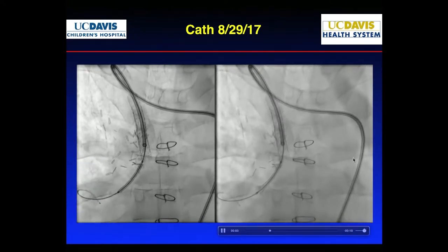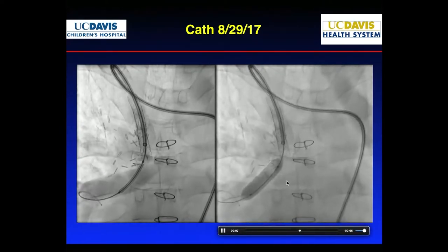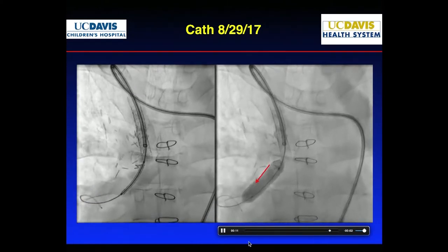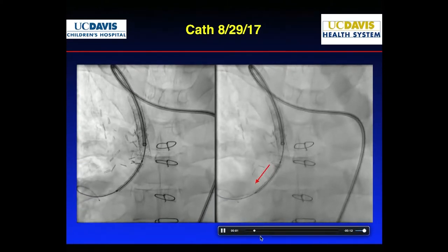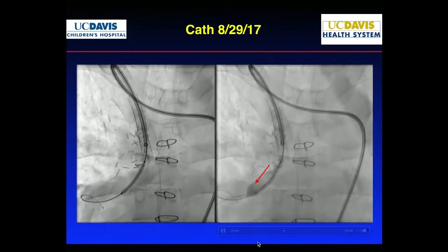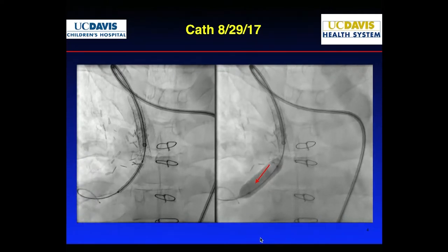So of course, with all the curves, we don't have a lot of control over the wire. And you notice that as we inflate, notice that little subtle movement, right? So I'll show it again. As the balloon was inflating, the stent actually shifted a little bit forward. So it's not in the right position now. We might have ballooned it, but certainly it's not holding up in the stenosis.